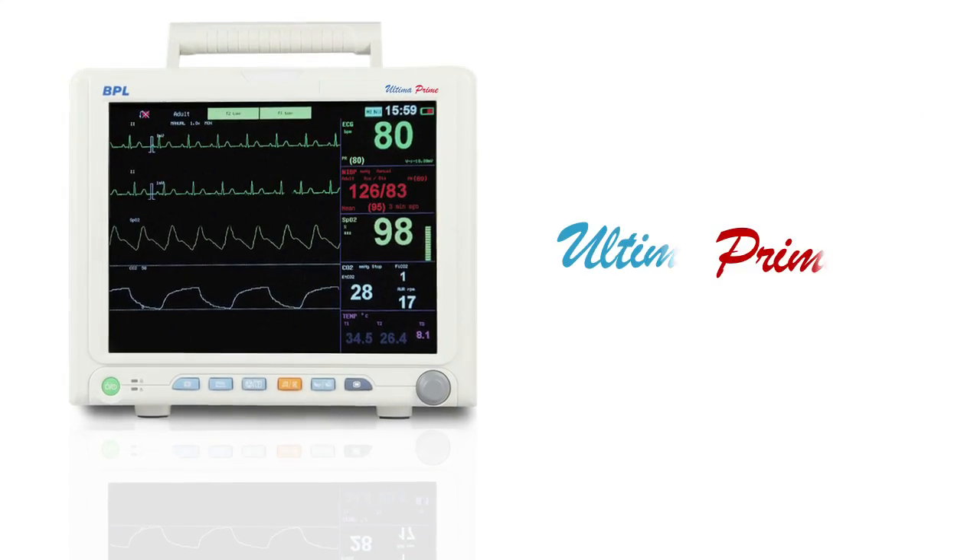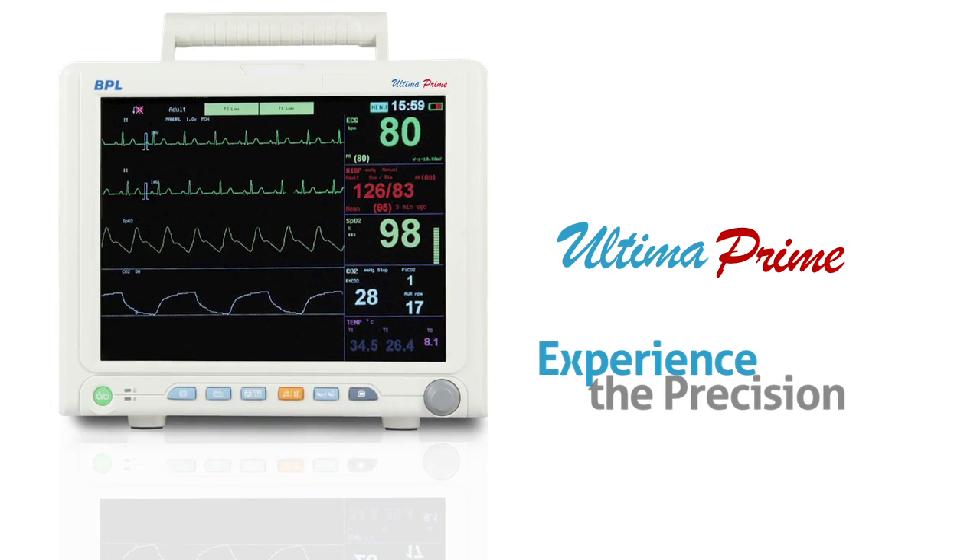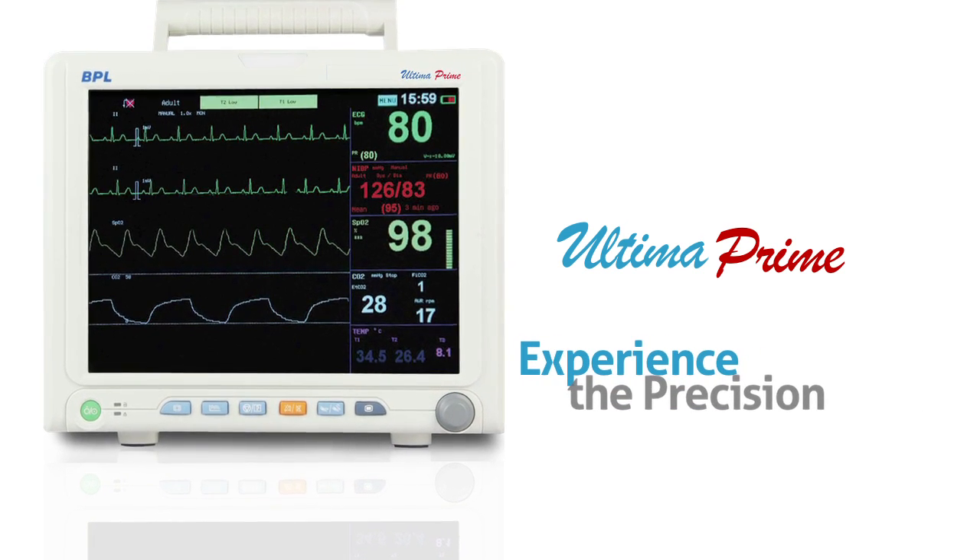Ultima Prime is the one-stop solution for all your critical care patient needs, providing efficient and comprehensive patient monitoring.